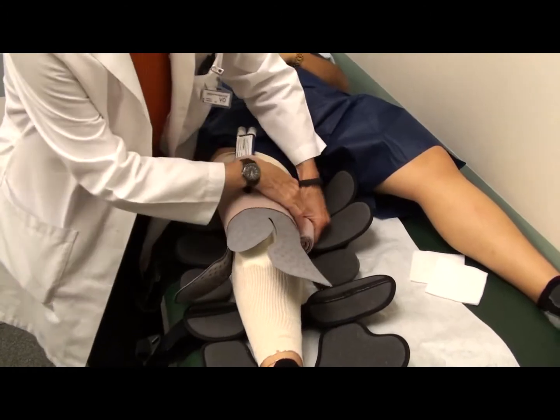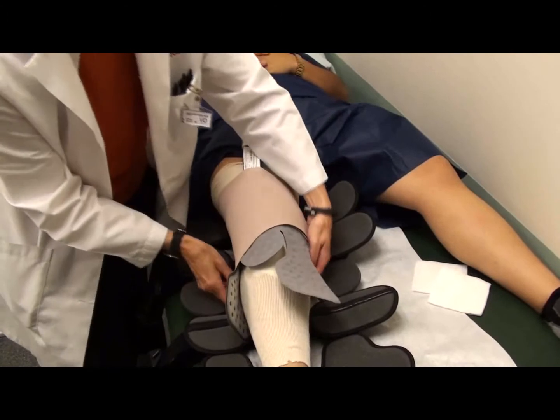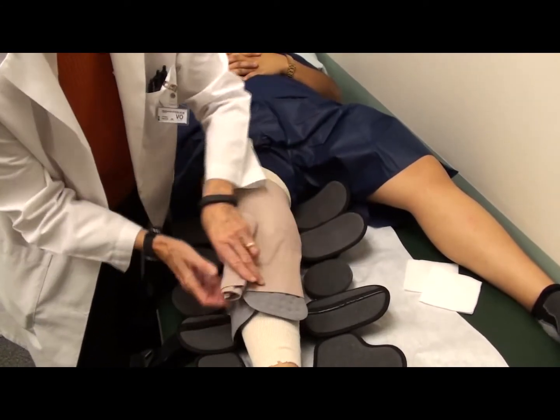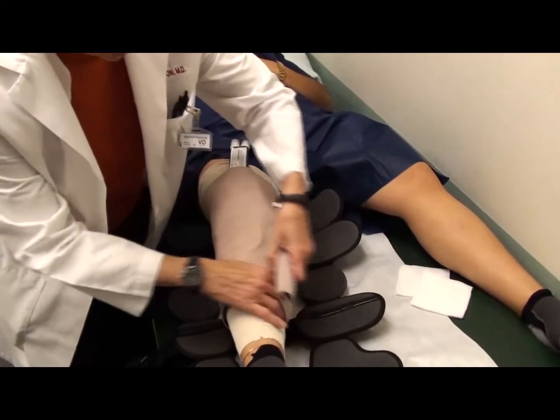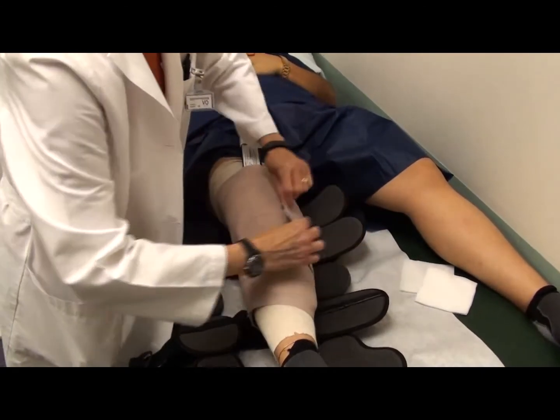Now again, you're on top of the stocking at this point in time because it will be much easier to remove it. You can leave your wounds and dressings alone. Now this can overlap. Your cold pad can overlap a little bit. It doesn't hurt a thing. And then you just wrap this back up lightly. You don't have to be tight. We don't like tight. And you put this back on.